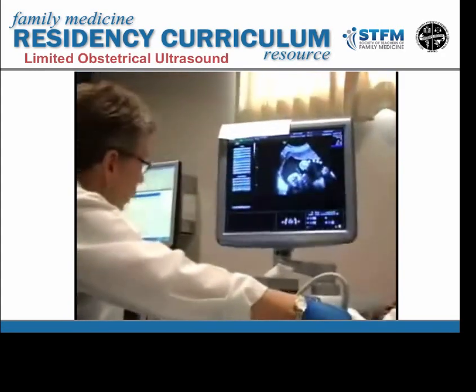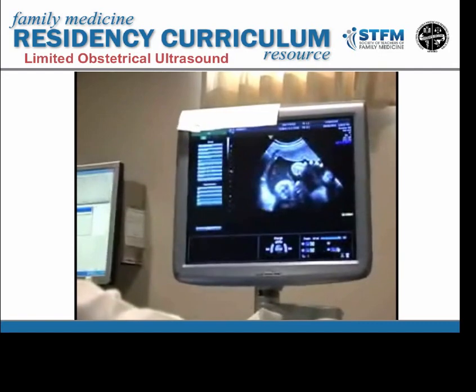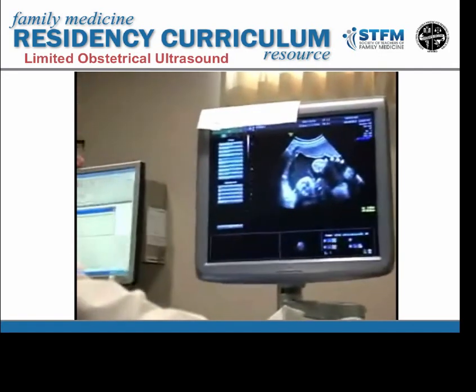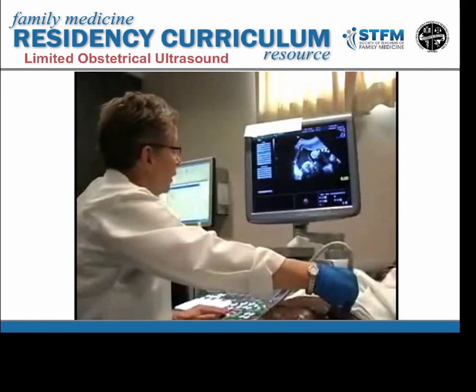I'm then going to move to the next quadrant, which is the left upper quadrant. I'm going to measure another quadrant up here. And in this case, this pocket is 6.7 centimeters. You notice that I don't measure when I'm doing the measurement through fetal parts, so I'm going to be avoiding going through fetal parts.